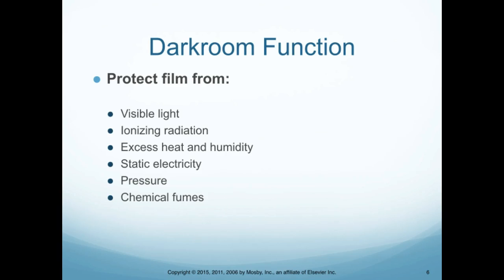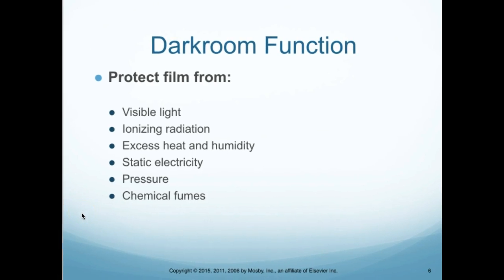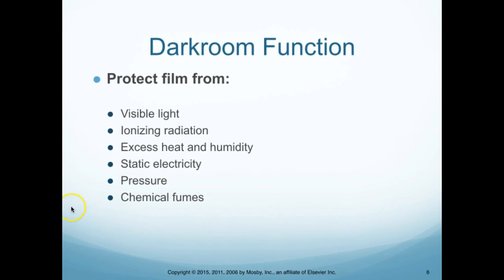If it's very, very windy outside, it causes a lot of static electricity, and if you were to touch a film and give a shock to the film, you would actually see almost a lightning bolt pattern through that film once it is processed. It's really interesting there. Make sure the pressures are right in the room itself and chemical fumes are ventilated.